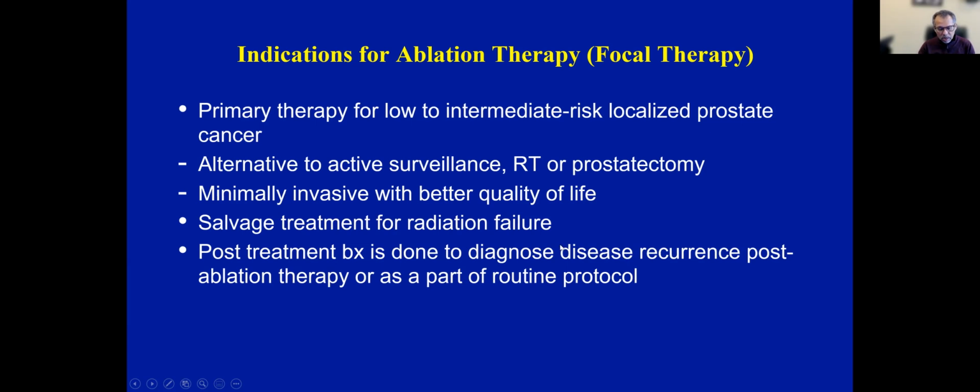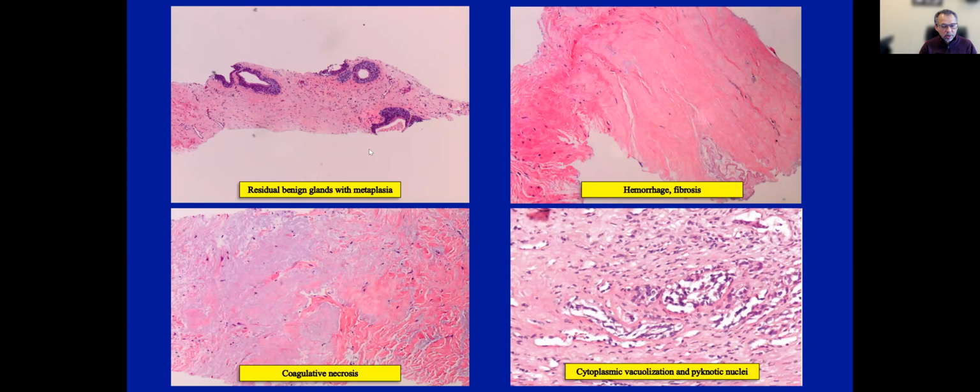And if you cannot elicit some of these morphological changes, which I am going to show you, you can often miss the evidence of treatment, because unless you dig for a detailed clinical history, this information may not be readily available. In this setting, tumor is typically graded, but there are no systematic studies for this type of treatment. As more experience builds, we will know better about these treatment effects and whether it should be graded or not. But if I see a lot of treatment effect, I usually do not provide the grade, and I put a comment stating that there is morphological evidence of treatment effect.